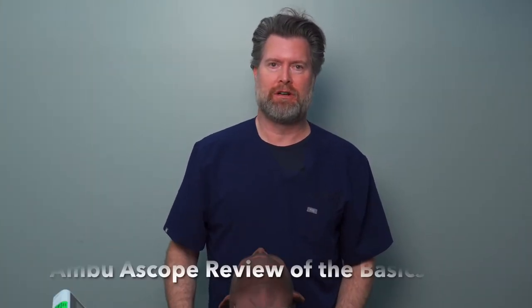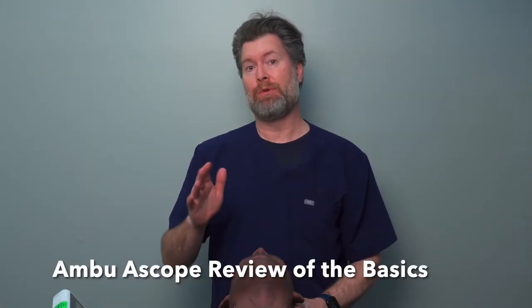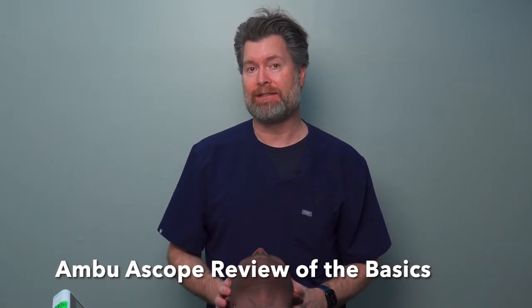Hey everyone, I'm Dr. St. George. We're going to do a short video on the Ambu A-Scope today to give everybody a sense of some of the basic bells and whistles, how to plug it in, how to turn it on and off, and then just a quick basics of intubation technique using the fiber optic A-Scope. So let's get started.